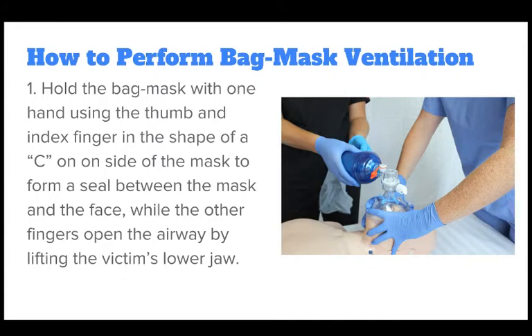After the other rescuer delivers 30 high quality chest compressions, hold the bag mask with one hand using the thumb and index finger in the shape of a C on the side of the mask to form a seal between the mask and the face, while the other fingers open the airway by lifting the victim's lower jaw.